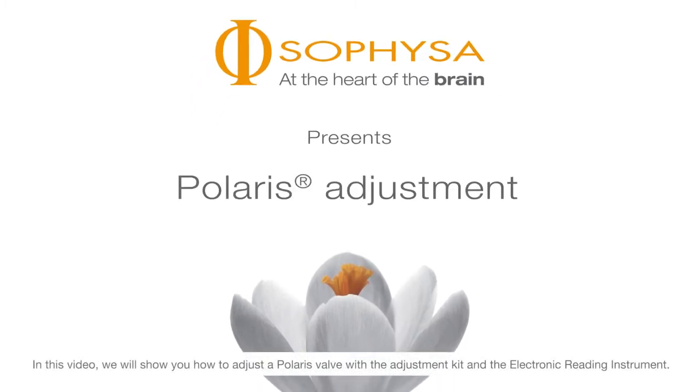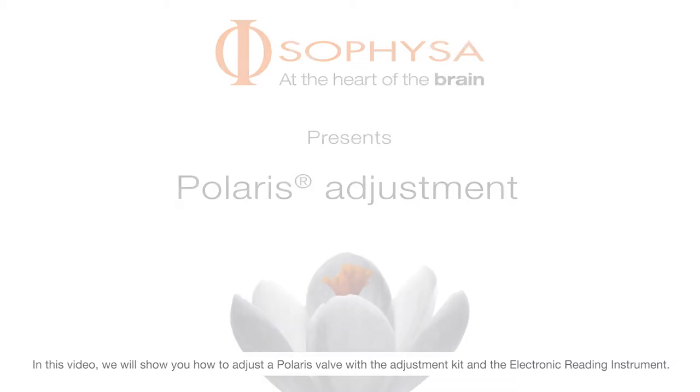In this video we will show you how to adjust a Polaris valve with the adjustment kit and the electronic reading instrument.